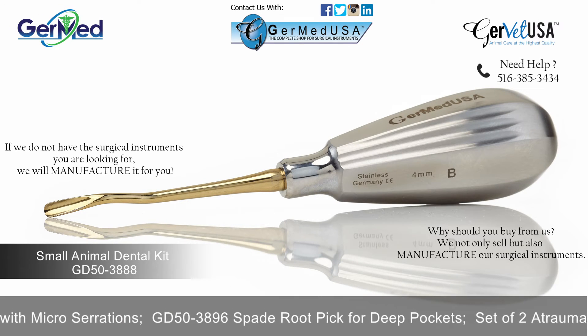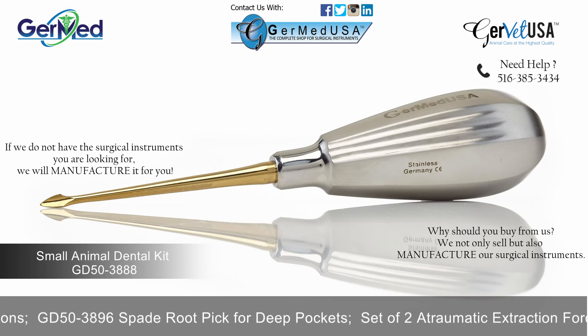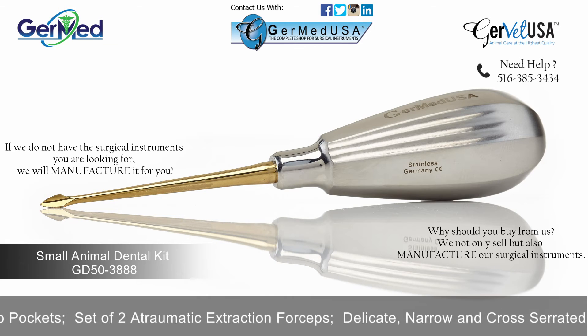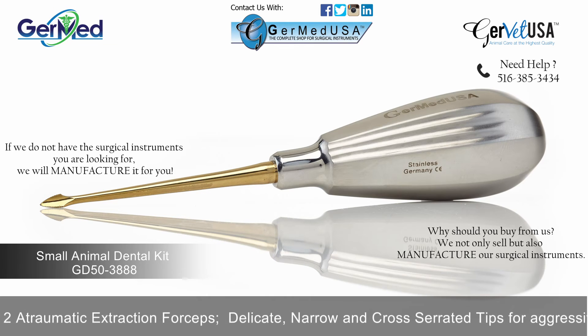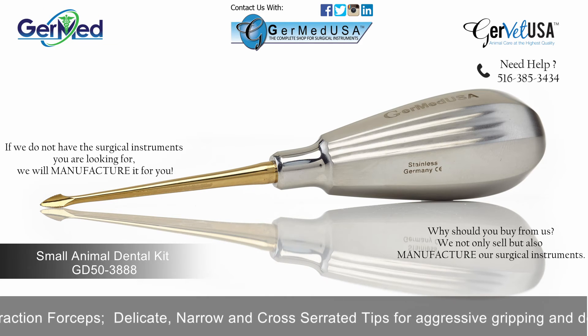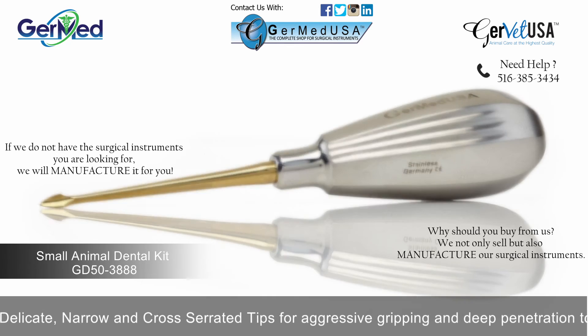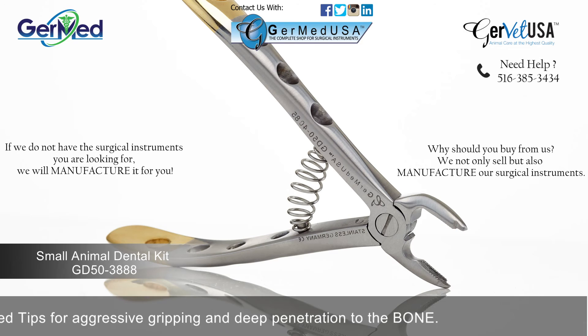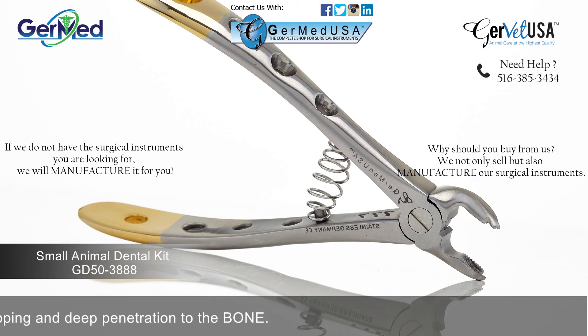A spade root pick for deep pockets. The spade root includes a delicate narrow and cross-serrated tip for aggressive gripping and deep penetration to the bone. Germed also offers atraumatic extraction forceps with delicate narrow and cross-serrated tips in order to achieve gripping and deep penetration to the bone.